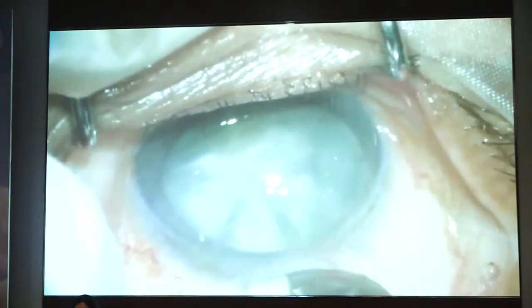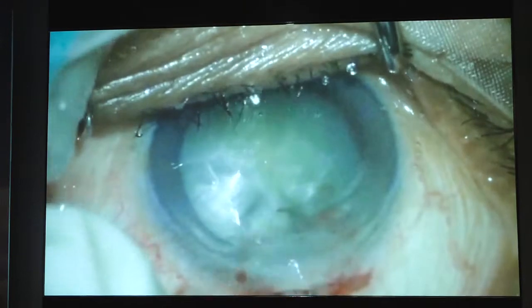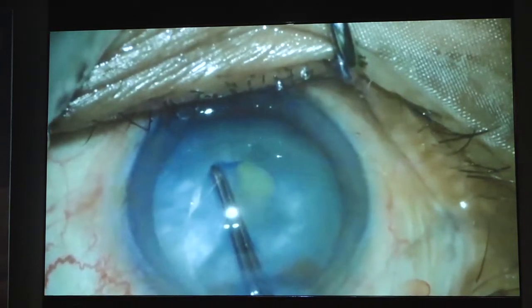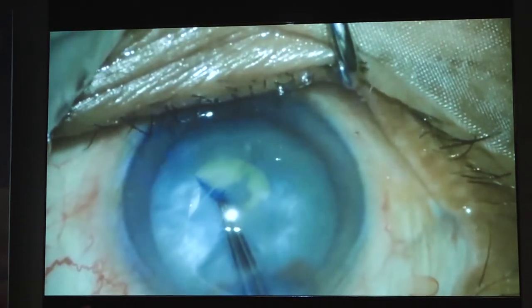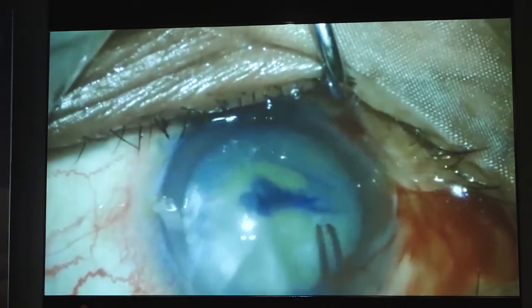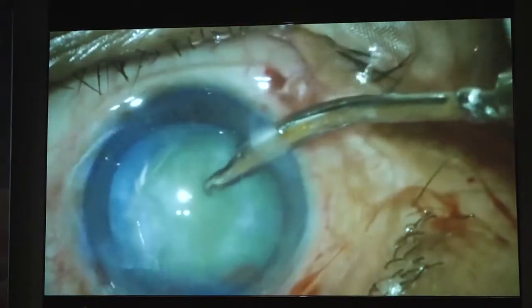So this is a video of a 4 millimeter incision, a hypermature cataract, that too phacomorphic. I tried doing this in a 4 millimeter incision. You can see I am close to the limbus, and I am trying to do the rhexis. In a hypermature cataract, you all know there could be an Argentina flag sign. Since the cataract is large, you have to make a large capsular rhexis, and forceps comes into play here. You see it has extended a little, but gradually you inject Visilon, and then you can pull it towards the center.